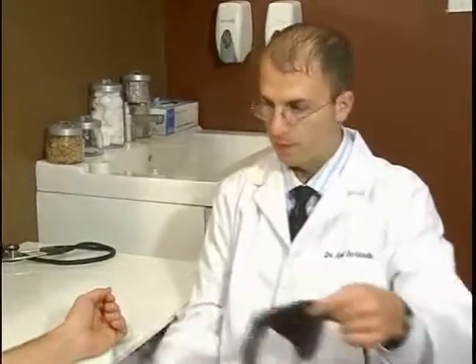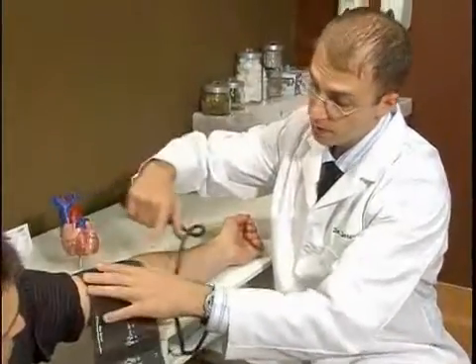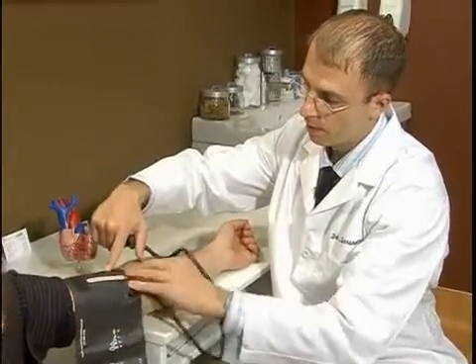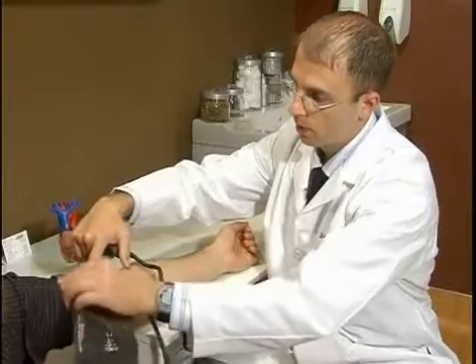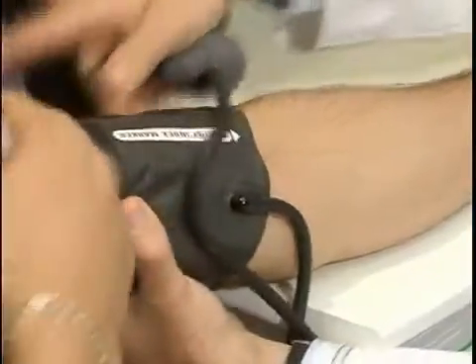We want to talk about the placement of the blood pressure cuff and the placement of the stethoscope. In general, you want to be a couple of centimeters above the elbow crease. You don't want any clothes constricting around the blood pressure cuff.